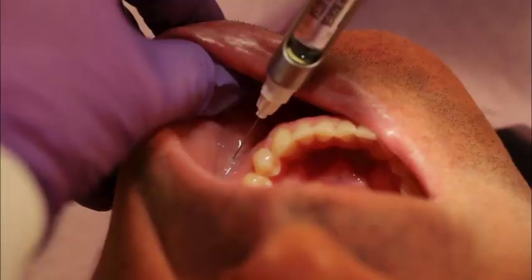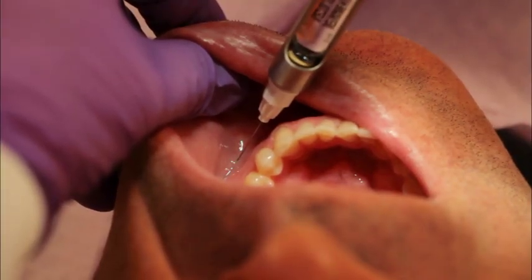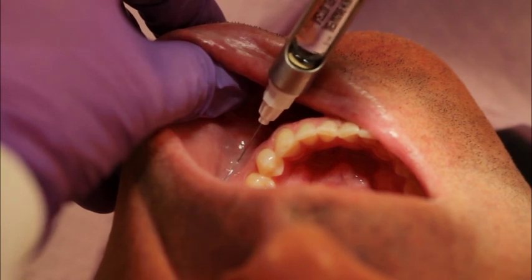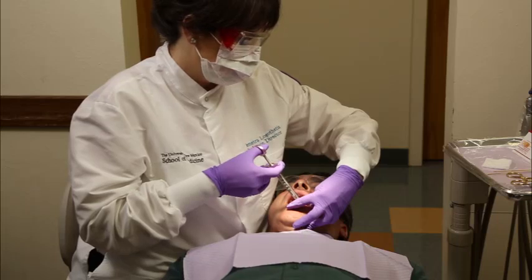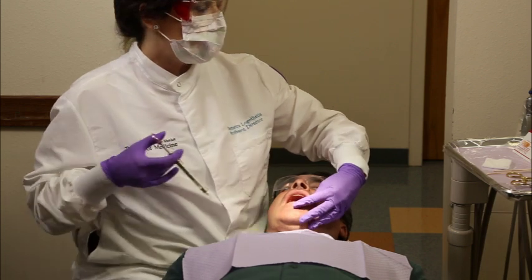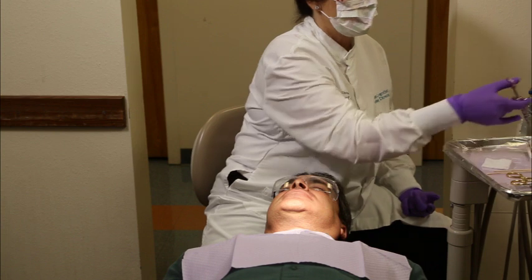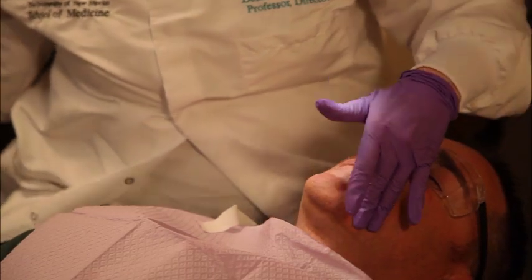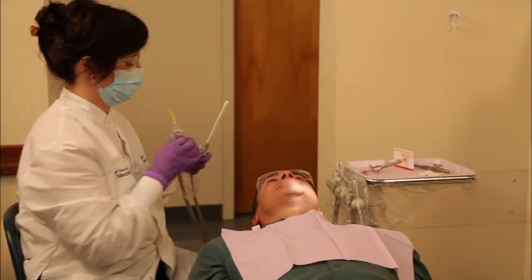If aspiration is negative, slowly deposit 0.6 to 0.9 milliliters, or 1/3 to 1/2 of the cartridge over 30 to 60 seconds. If the tissue balloons, the injection is too rapid, and you should stop the deposition and remove the needle. Carefully withdraw the syringe and immediately recap the needle using the one-handed scoop method with a needle sheath prop or other recapping device. If pulpal anesthesia is required, apply firm pressure to the injection site for a minimum of 2 minutes to help the solution enter the mental foramen and anesthetize the incisive nerve. Then rinse the patient's mouth.